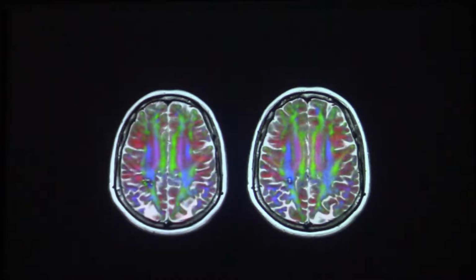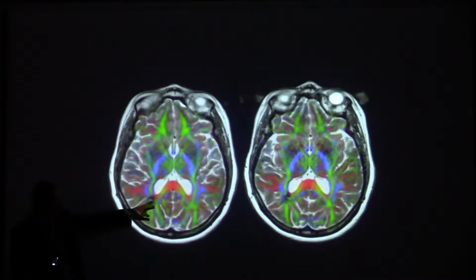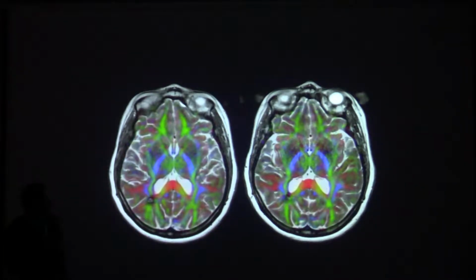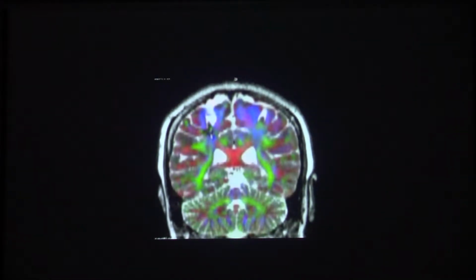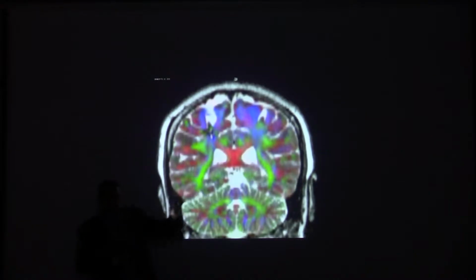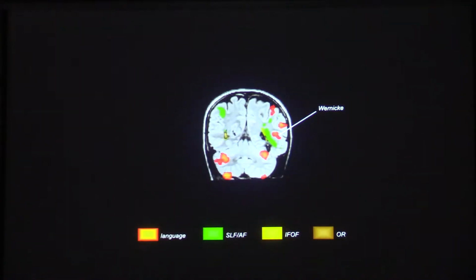So the surgeon decided, well, there were some more pictures here, I think. So this guy here, that one he couldn't touch. So what about here? There's a lesion in the parietal white matter, and if he tried to take this out, what's going to be inflicted here? Optic radiation. Now that's going to be a major problem too, right? So he decided, okay, he's not going to do that. I think you can probably tell where things are without diffusion tensor imaging. So that's another coronal image showing it. This is actually kind of interesting. The other lesion is right next to the arcuate fasciculus as well. So this was a little bit too close for him. So he decided not to operate on those things, and essentially we did radiation.